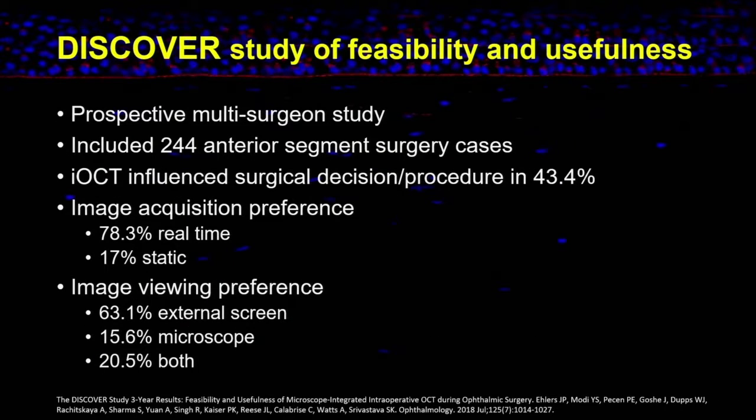But how practical and useful is intraoperative OCT? So the Discover study recently looked at this question, and they prospectively looked at 244 anterior segment surgery cases, and they showed that this technology influenced the surgical decision in over 40% of cases. The images were acquired in real time.